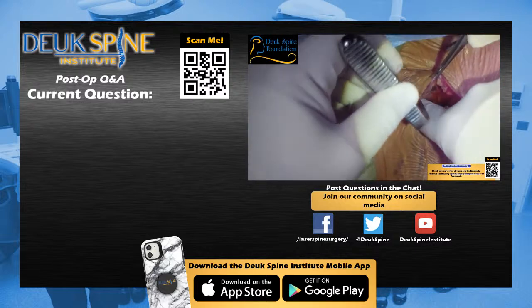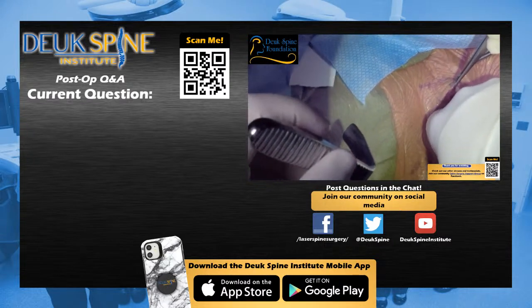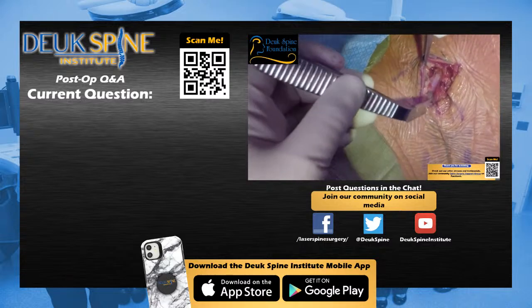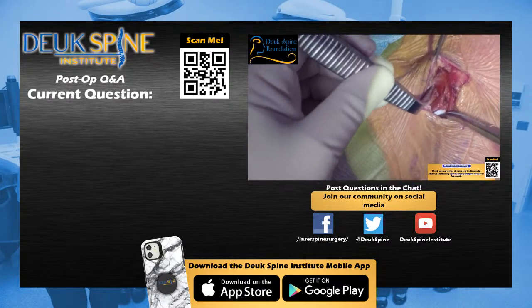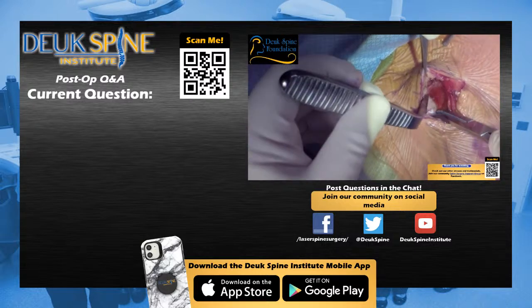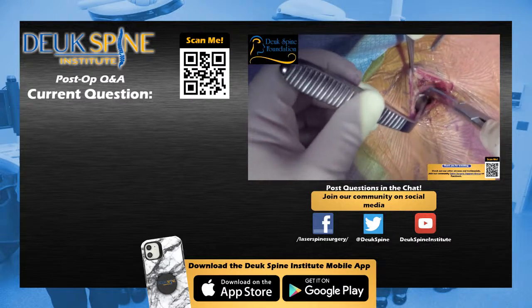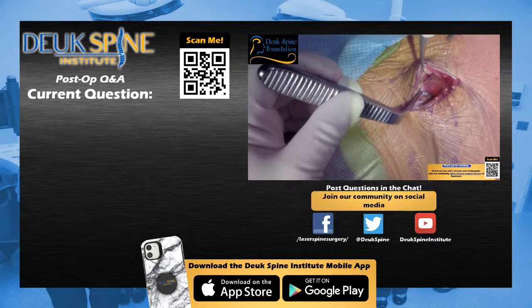We'll monitor him, make sure he's hemodynamically stable, check his neurological exam and recovery, make sure he's up walking and peeing and he's wide awake before we send him home. We are going to put the patient in a collar. It's an Aspen collar we use. Other people use different collars, but it's basically an external rigid immobilization device. It has Velcro and plastic to hold and support the neck.